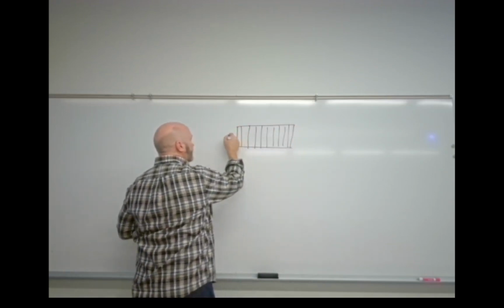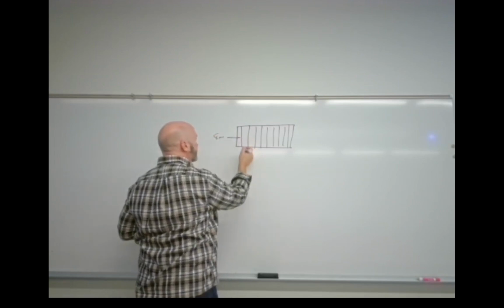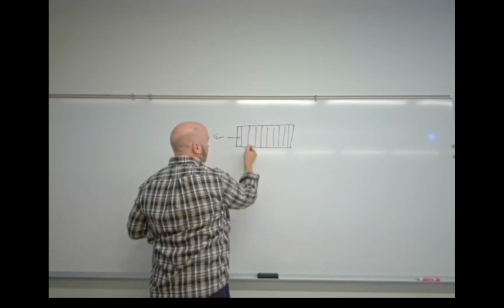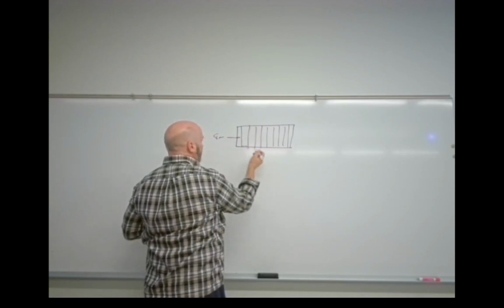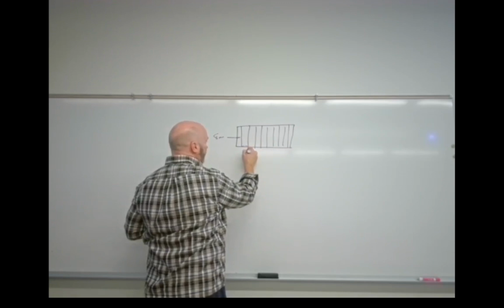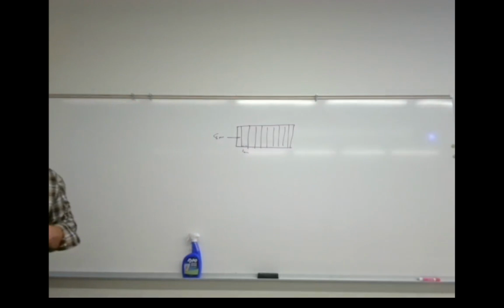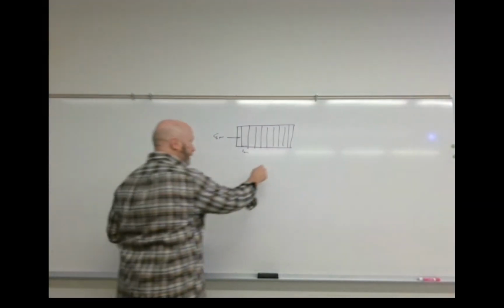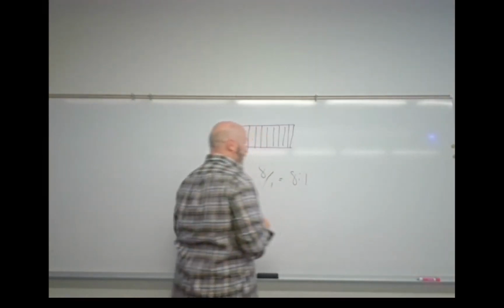So let's say that the height of the grid strips is 8 millimeters and the distance in between, let's say, this is not realistic, but the distance in between them is maybe 1 millimeter. Okay, so what would our grid ratio be? It'd be 8 to 1. It'd be 8 over 1, equals 8 to 1 grid.